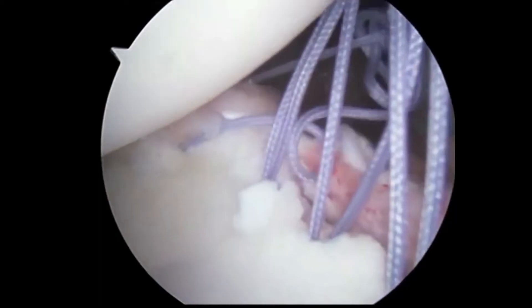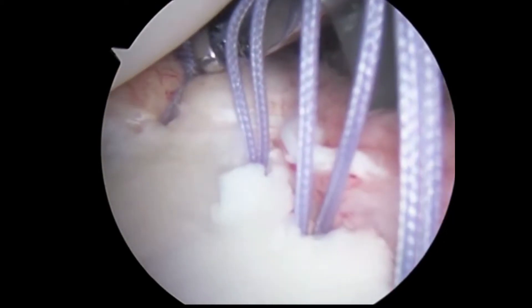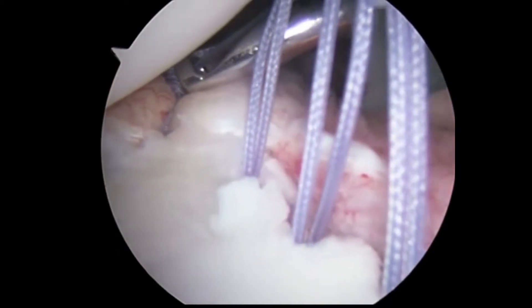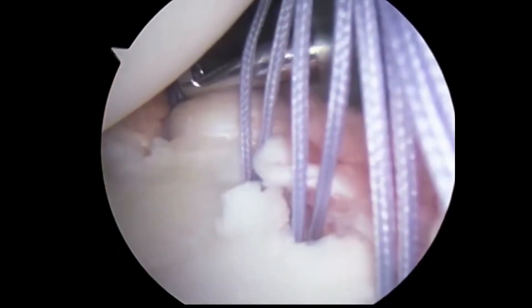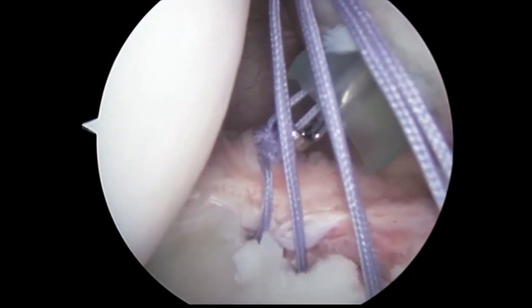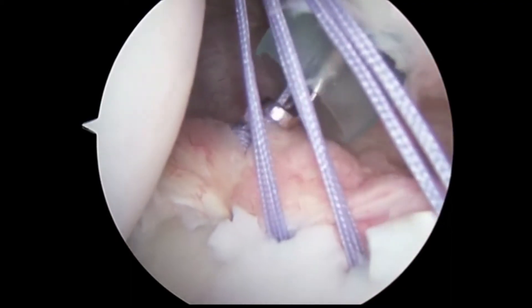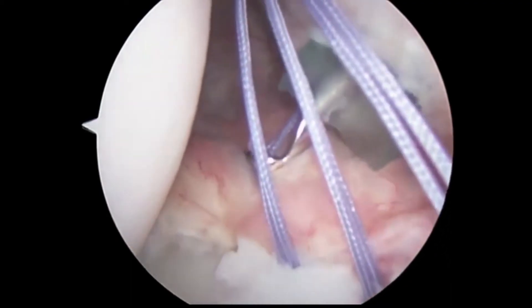Here the suture is being passed and we are using a knot tying technique to be able to secure the labrum back to the bone. This places the tissue next to the bone so that it can heal in the proper location. The sutures are then each secured independently to be able to bring the tissue back over to the bone.